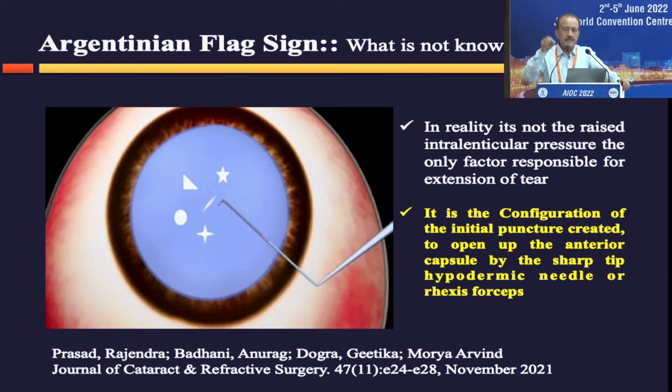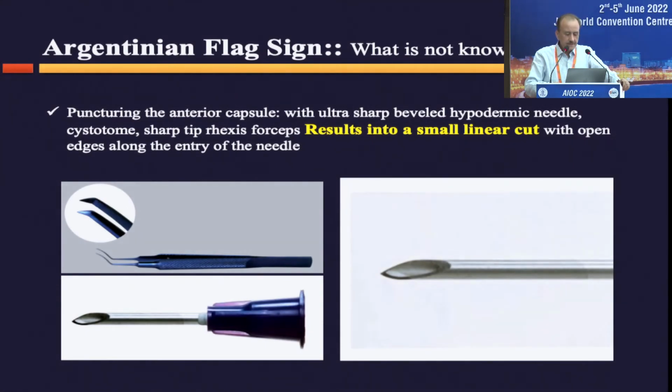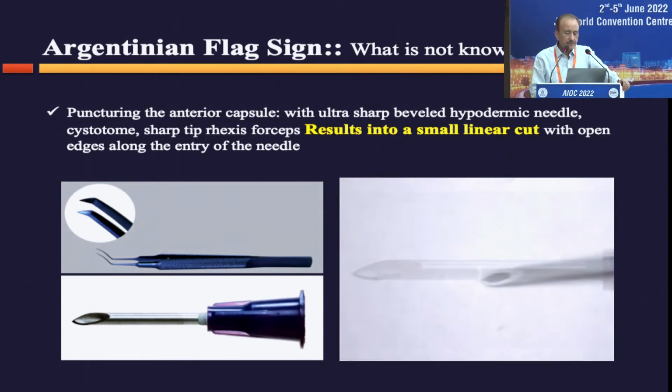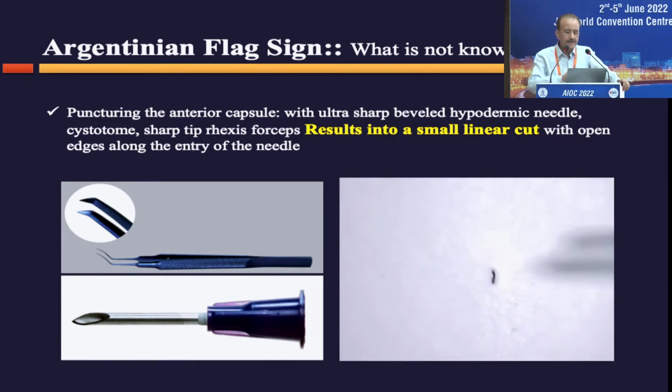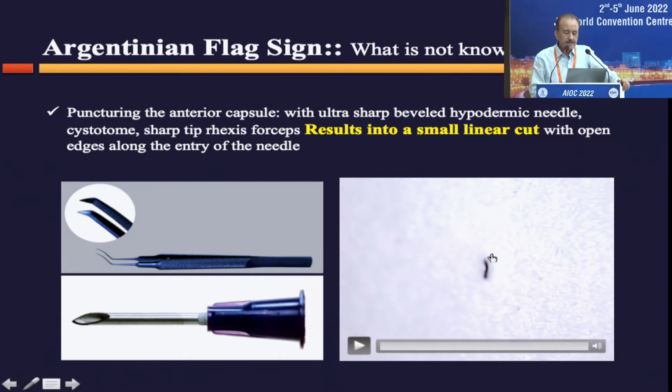Similarly with the hypodermic needle also. So why does it happen? You can see in this small video that when you are puncturing the capsule with a hypodermic needle, the needle will create a linear tear on the anterior capsule. So this is a linear tear. Now this linear tear has two open edges on both sides. It's not like a hole or something, it's a linear tear.